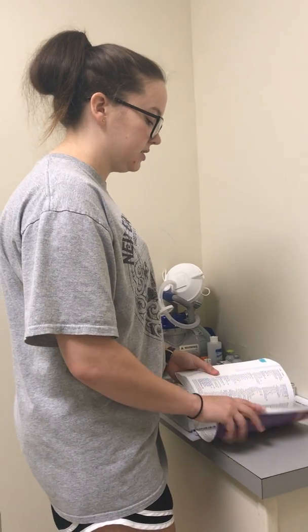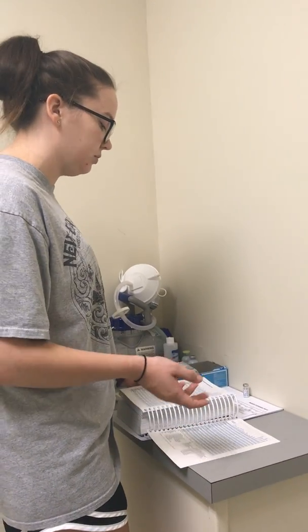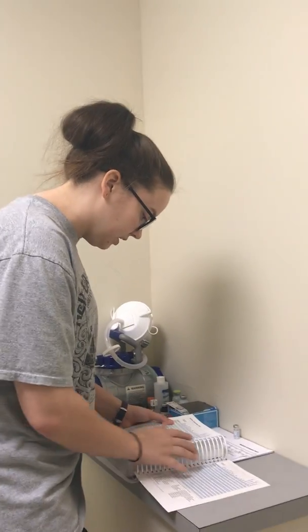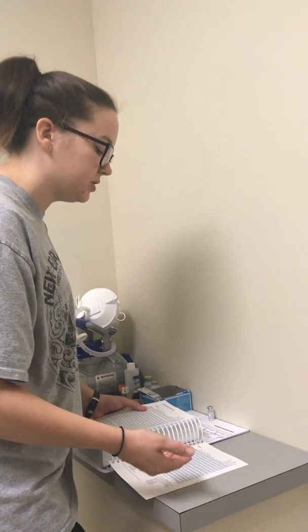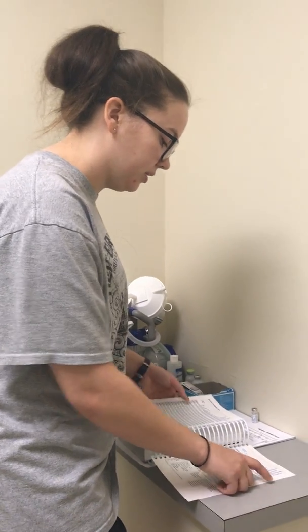I would check in the back to see if my morphine is compatible with my solution. The solution's already in the room, but I would look on my MAR and I would see that my patient has D5W in the room. I would check once I got in there again, but it is compatible with everything.